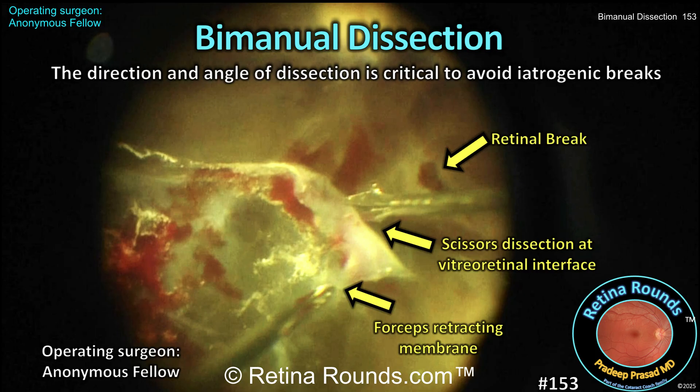Typically, this approach is used in cases of combined tractional and regmatogenous retinal detachment, where the underlying retina is mobile and dissection of tightly adherent membranes with the cutter alone raises the risk of iatrogenic retinal breaks. Since the technique requires the active use of both hands, it can be challenging for beginning surgeons. Our video today is presented by an anonymous vitreoretinal fellow seeking feedback on their surgical technique.